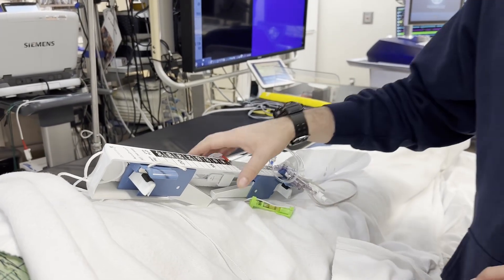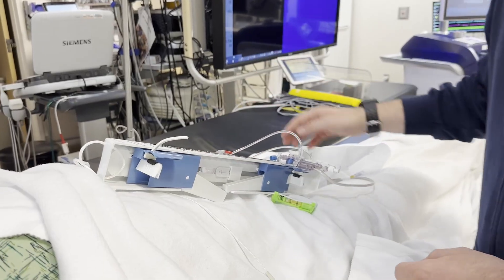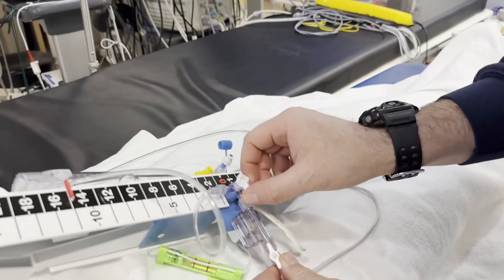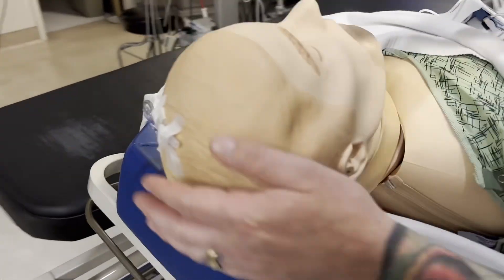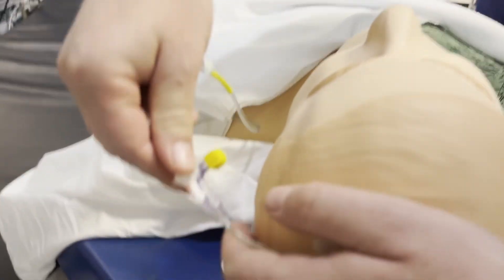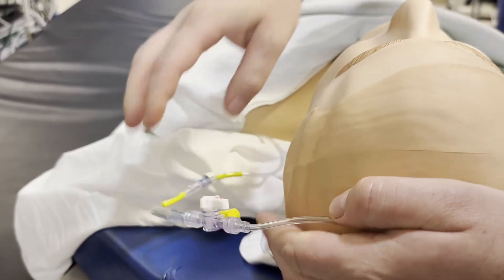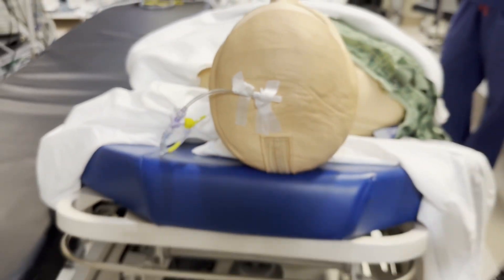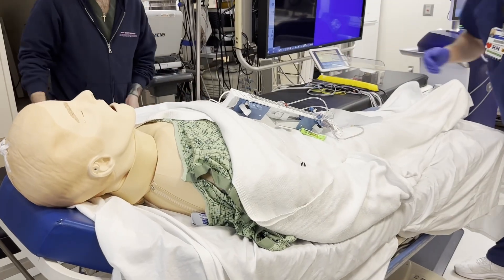First, the patient should have the drain on their body. It should be turned off to the patient — either here or at the head, closest to the patient — that would be off to the patient. So now we're going to safely slide the patient over.